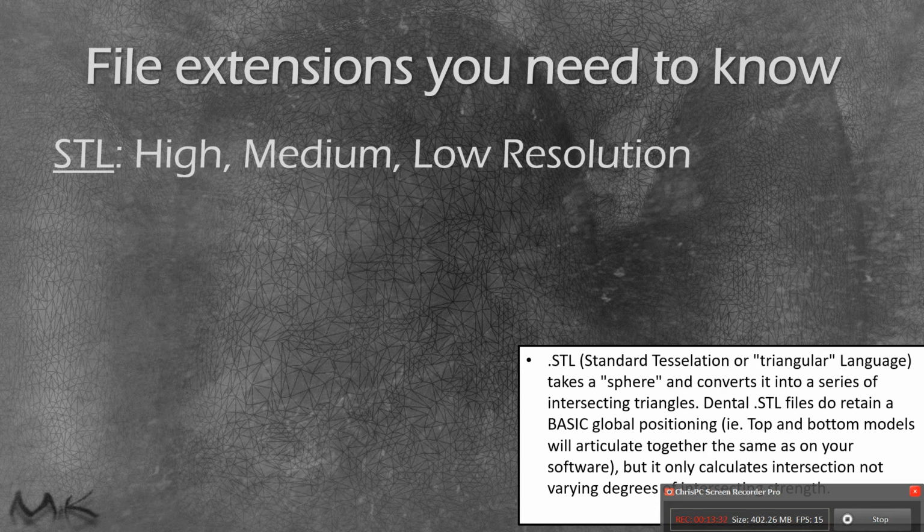Within the STL file, there's another couple cool things that it does. It actually gives you a basic global positioning of different dental arches. So if you scan a top arch and a bottom arch together, you actually get a basic global positioning of the top arch and the bottom arch in relation to each other. So a lot of our 3D planning softwares and a lot of our scanning softwares that come on our scanners will actually do this for us.